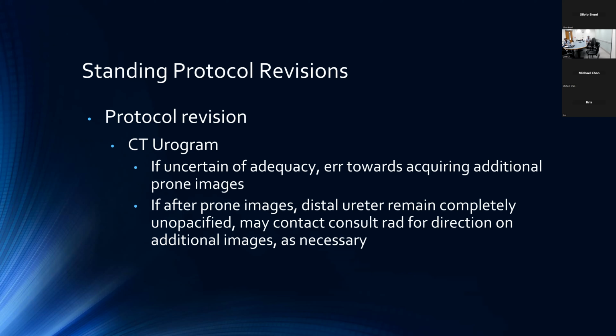Most of the time, I would say it's probably going to be fine to just call it at that point, because in cases of really severe obstruction, it may take substantially longer really to get contrast down there. So it's not necessarily worthwhile to keep the patient for 30 minutes, but as best we can, getting that initial prone image after 2 minutes will give us quite a bit more information over what we're doing now.